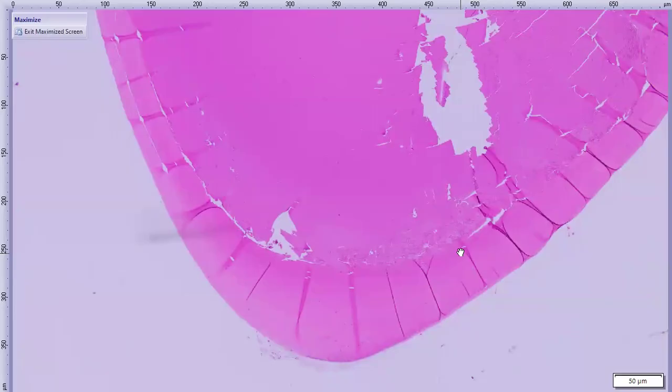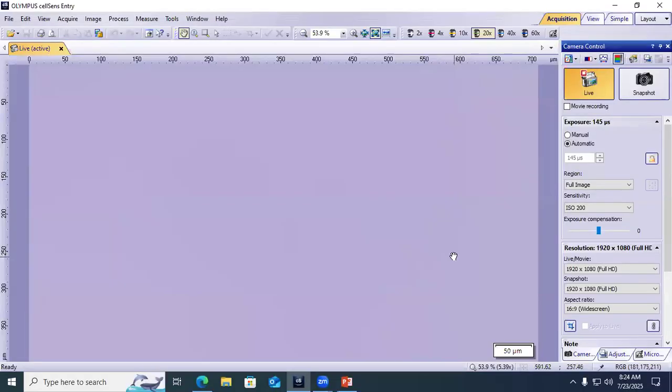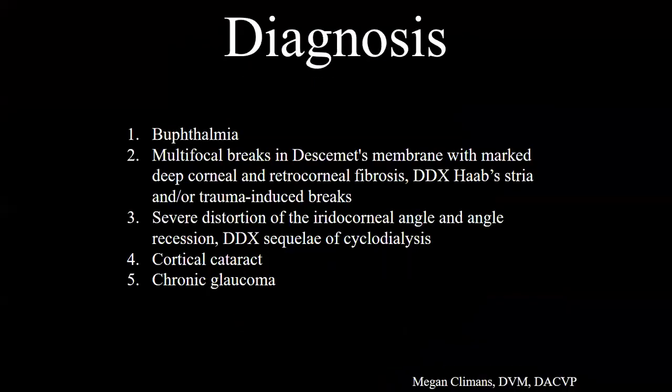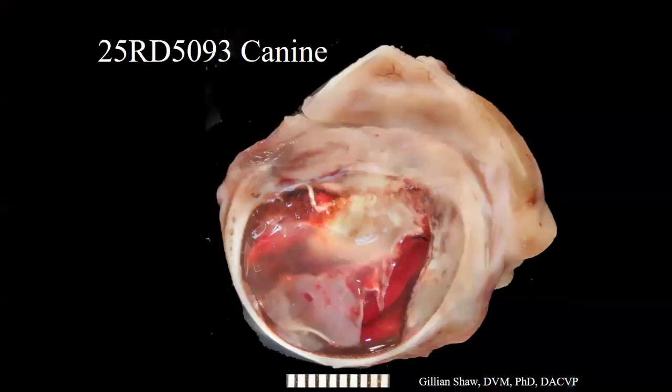Dr. Lee asked to repeat the discussion, but I think you just did. Okay, yes, good. It's the Galaxy Quest thing, where I've got to repeat what the computer said. Anyway, that's it. I'm going to move on. We'll show the diagnoses. There you go. And here's the next.